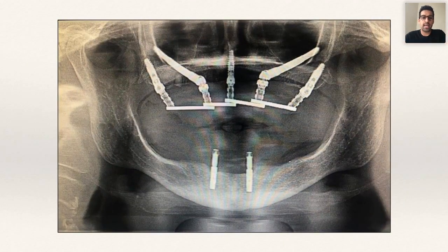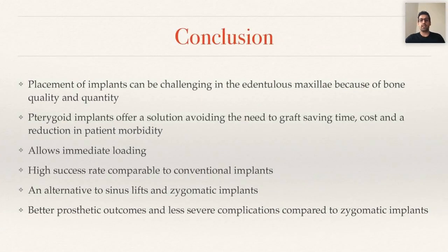And then we've got another case where we utilized a nasopalatine implant. We enucleated the nerve, placed an implant in the midline, single zygomas each side, and then single pterygoids each side. So, perfect AP spread. In conclusion, the important thing to remember is: simple surgery, complex territory.